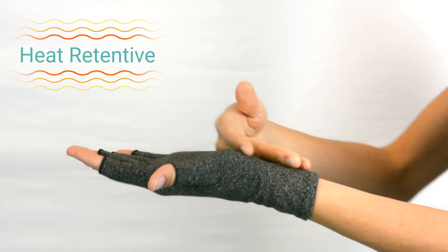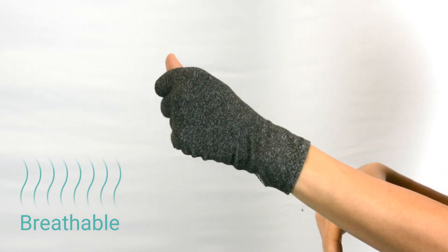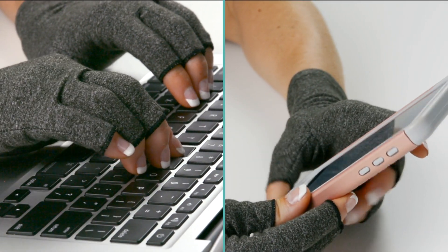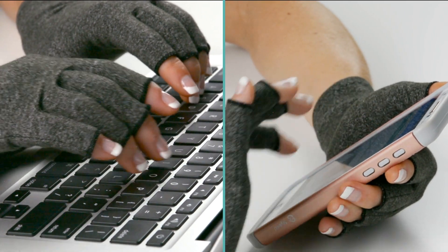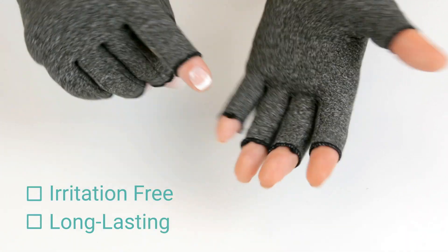The heat-retentive gloves deliver soothing warmth to aches and pains, yet are breathable enough to provide comfort for all-day wear. The open-finger design allows you to easily perform everyday tasks, like using your cell phone or computer. With smart seam stitching, the gloves are irritation-free and long-lasting.